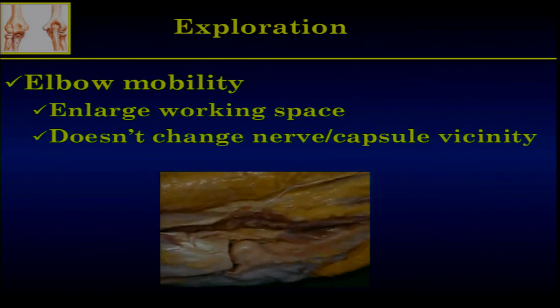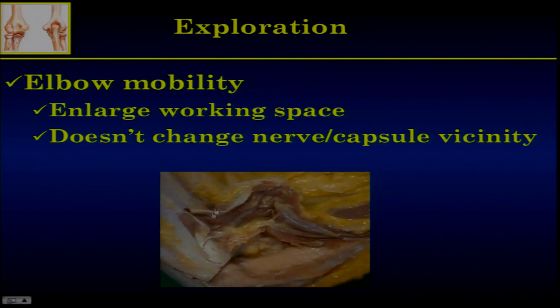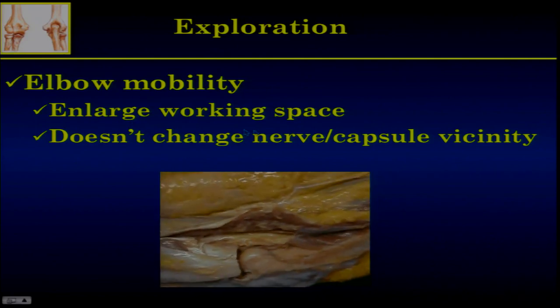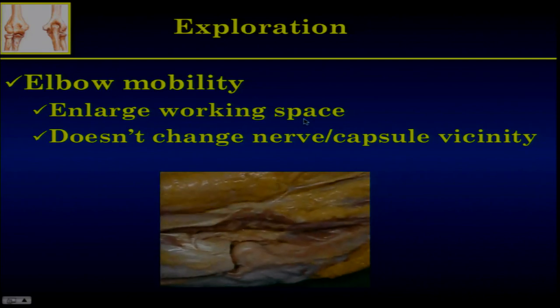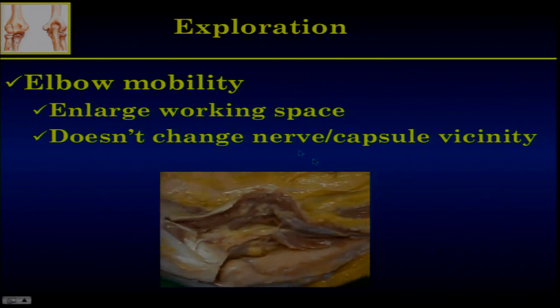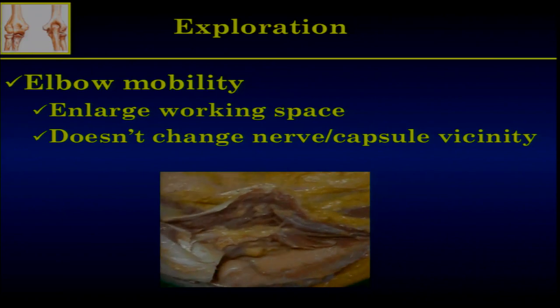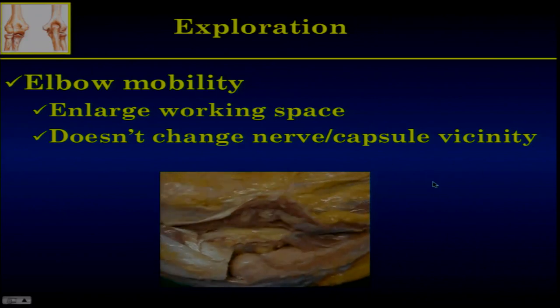Something important: you have to keep the joint mobile because it enlarges the working space. By bending the elbow, you enlarge the anterior compartment. By extending the elbow, you enlarge the posterior compartment. And once more, this doesn't change the nerve-capsule vicinity — it just enlarges your working space.